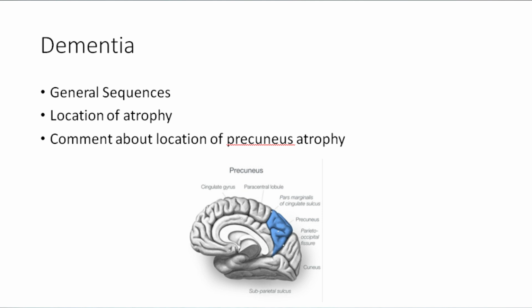We are not doing volumetric study routinely. Even in the US, we don't do volumetric study. But as a clinician, I want to know what the radiologists feel. Even my suspicion is something different. And let me tell you, my dementia patients, I report myself, because I have never seen even a single report where somebody commented what part of the brain is atrophic and more so compared to the other parts of the brain.